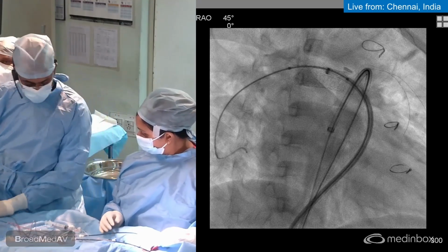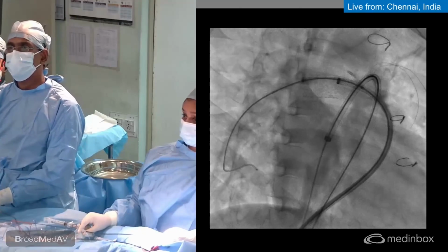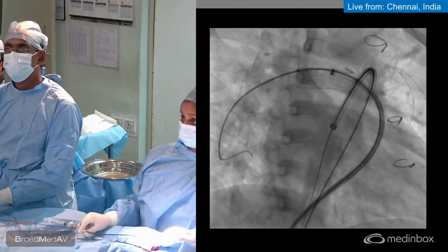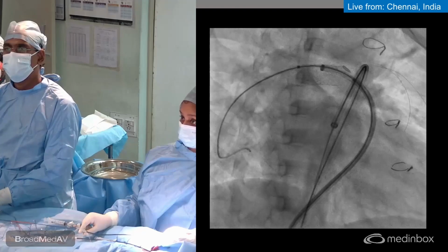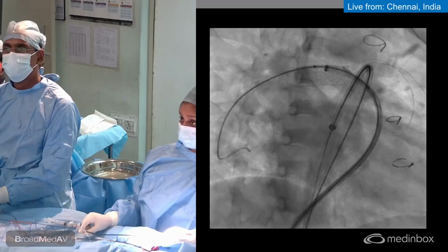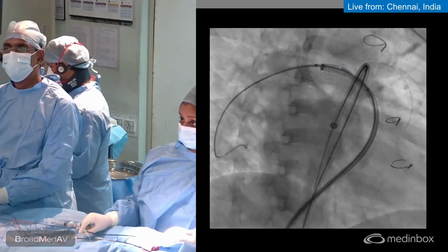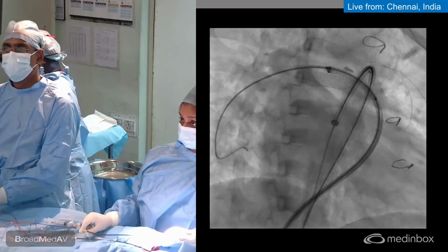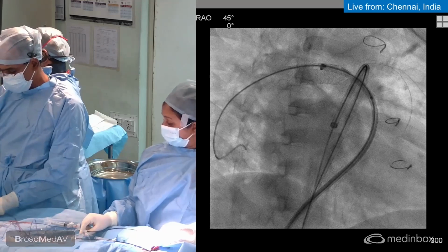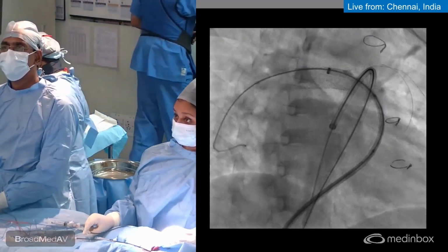No. So now I need a 12 millimeter Mustang balloon. Have we deflated? Have you given a negative? Fully negative.